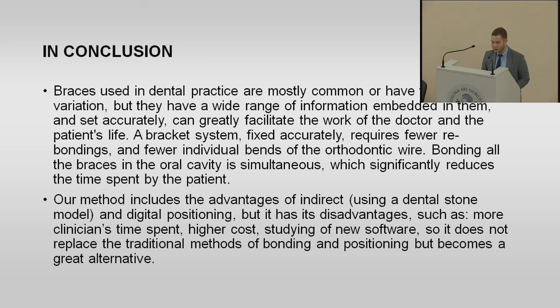Our method includes the advantages of indirect bonding, using a dental stone model, and digital positioning, but it has disadvantages, such as more clinical time spent. Well, you can reduce this factor with the help of your assistant or two or three of them. That's only your decision. Also, higher cost. It's higher than a traditional method, making just one dental stone model. Studying new software, well, the programs that I've mentioned earlier. So it does not replace the traditional method of bonding and positioning, but becomes a great alternative for several clinical situations.